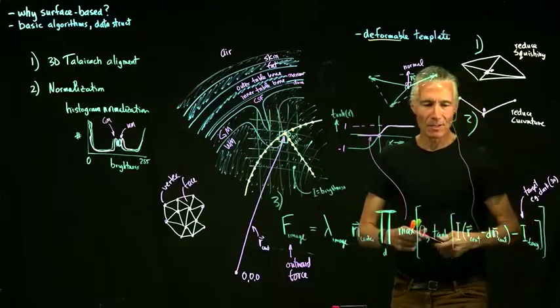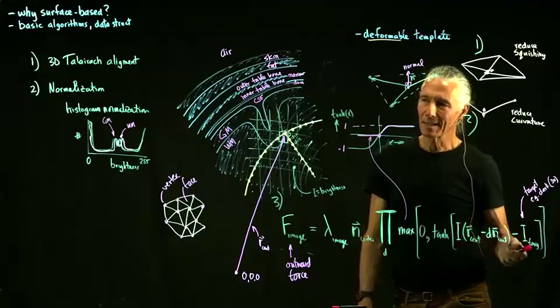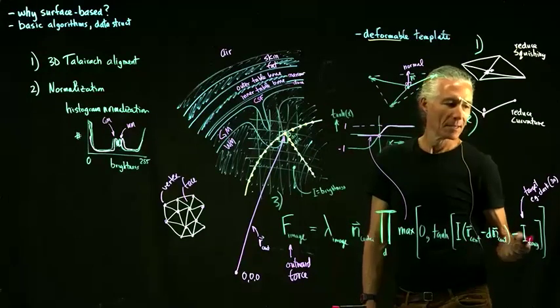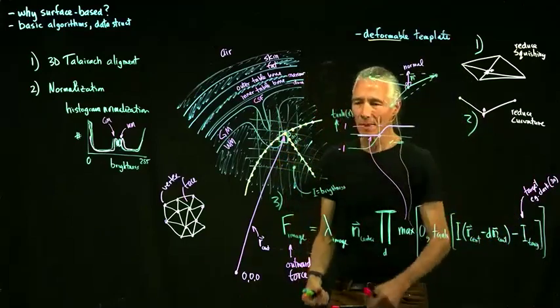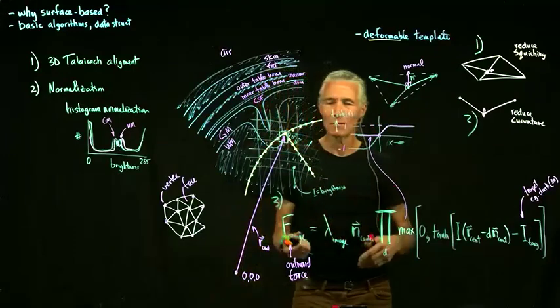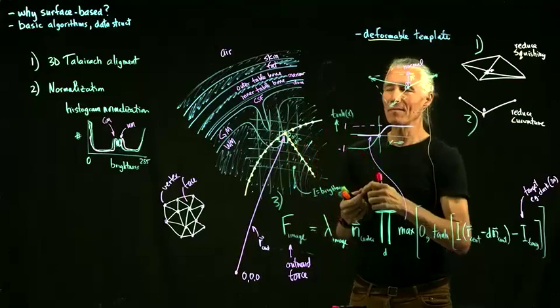It'll be 0 as soon as the value of the image voxel gets less than the target voxel brightness of 30. Then that will turn off the force. And this is just for one vertex, but you do it for all of them at the same time. A thousand of them, a couple thousand of them at the same time.